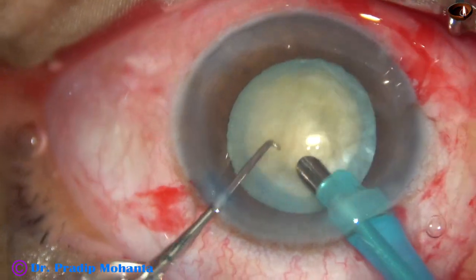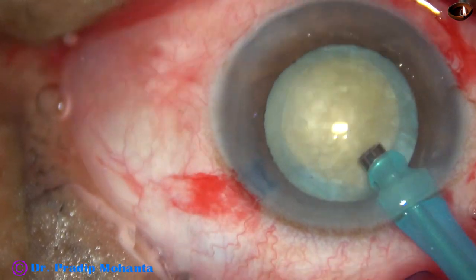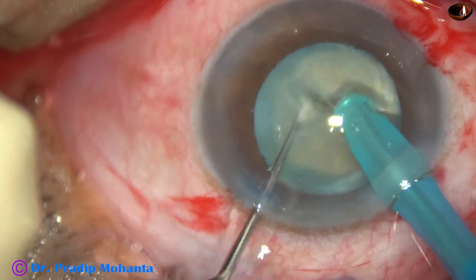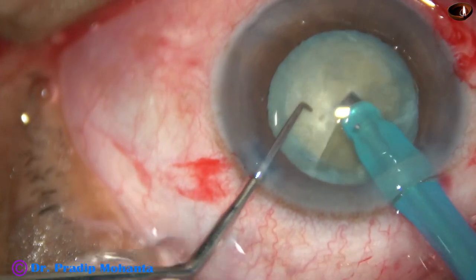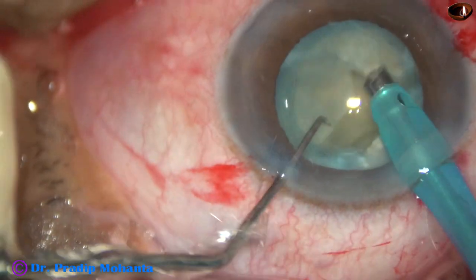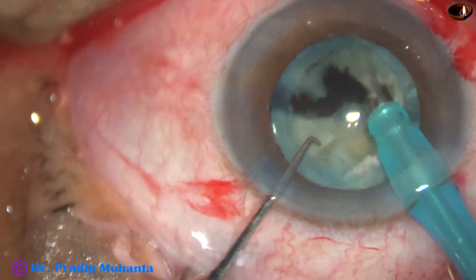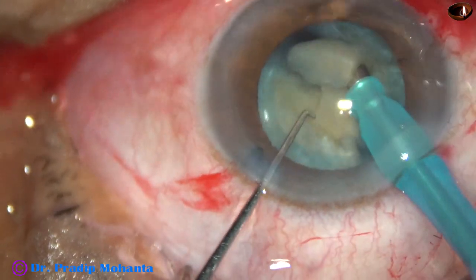And now, this is some superficial cortical matter being aspirated. Now the handpiece is turned, bevel up towards the cornea. See the direct submarine chop — the tip is buried into the substance of the nucleus, most through the nucleus, and the nucleus is chopped. See a lot of loose cortical matter just behind the nucleus. The nucleus has been chopped into several fragments.